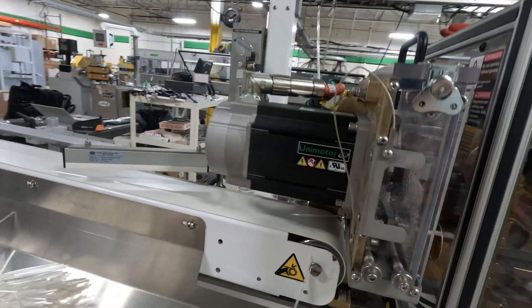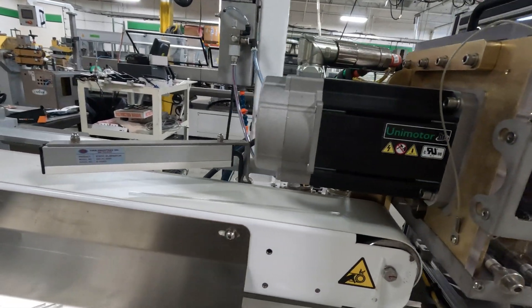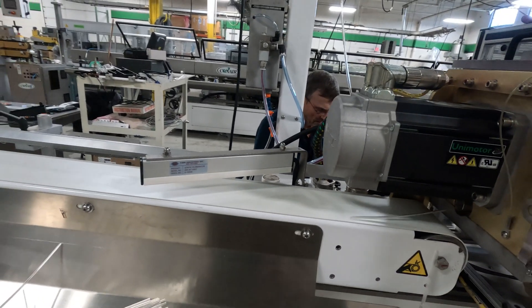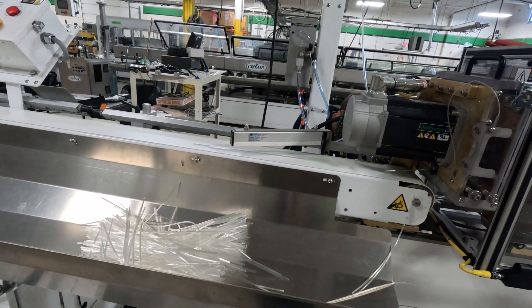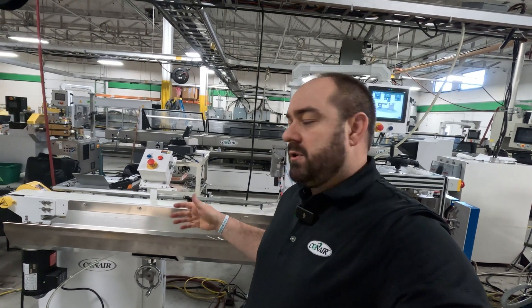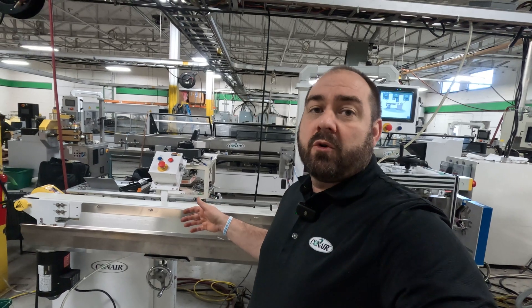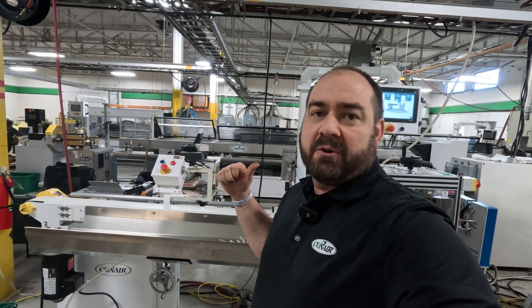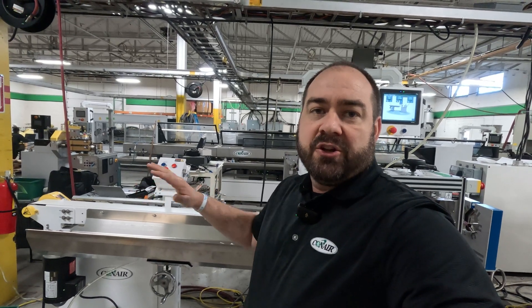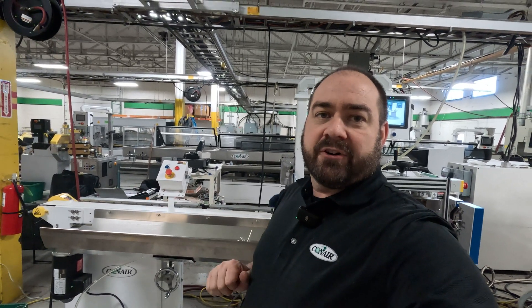It does have a puller section and then a servo-driven cutter. It exits the puller-cutter onto a takeaway conveyor where we are using blow-off to evacuate the line. You can set your takeaway conveyor to blow off the good parts, or using quality assessment from the rest of the line you could blow off your bad parts and let your good parts go into a bin. You can set that up however you like at your factory.